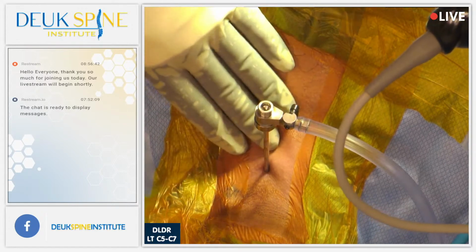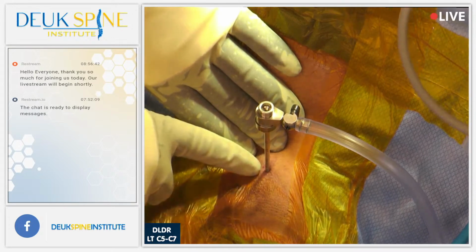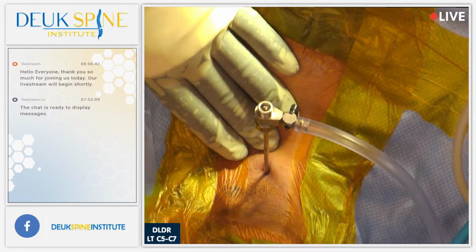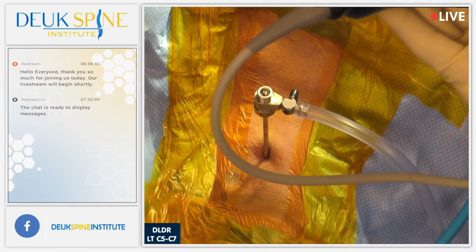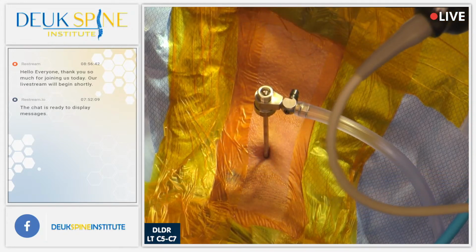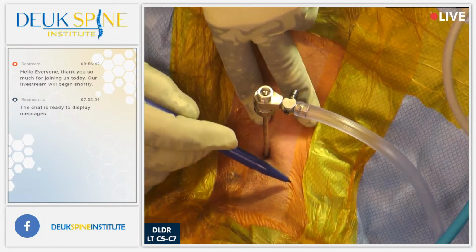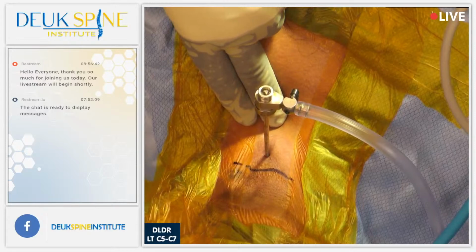All right, take a look at how small this incision is. You guys see this? Yes, we do. 4 millimeters. The entire surgery normally would be done with a huge incision, okay? If you go get an anterior cervical discectomy and fusion or an artificial disc, this is what they're going to do to you. All right, now just compare that to that.